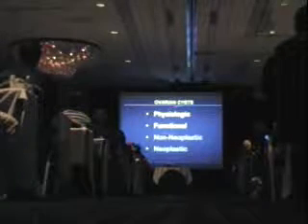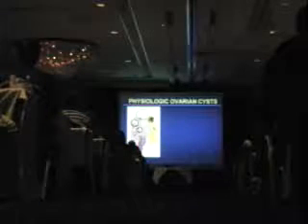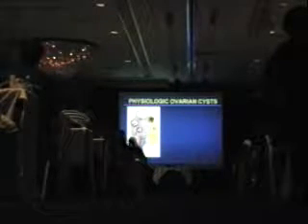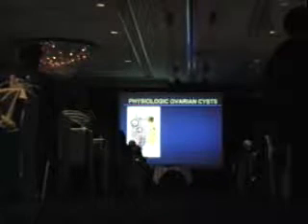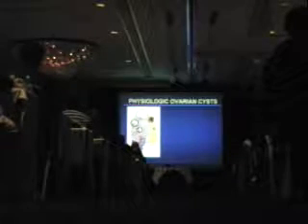In terms of the discussion and terminology, it is to separate physiologic and functional, because the names that we give these cysts are similar. Dr. Netter, my good friend, the cycle. Ideally, I'd like to scan at the beginning of the cycle here before you have any dominant follicles or anything in the ovaries, right after your menses. Good time also to look at the endometrium. I ask every woman 2 questions when I do a pelvic exam. If you're pre or postmenopausal, I say, when was your last period and are you on hormones? And I want to know the answers to that to interpret what I expect to see.